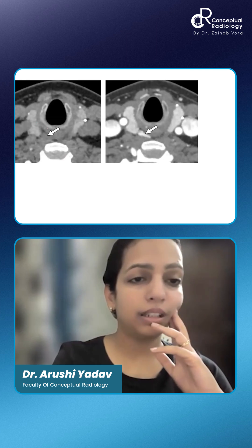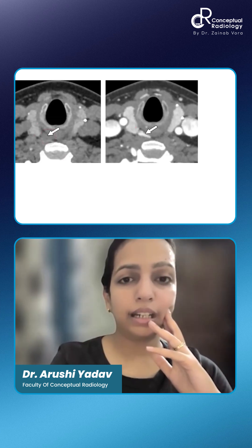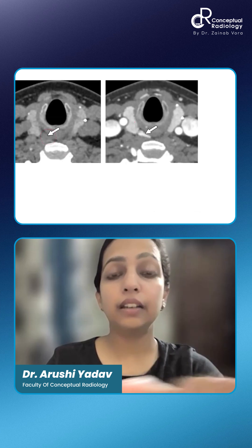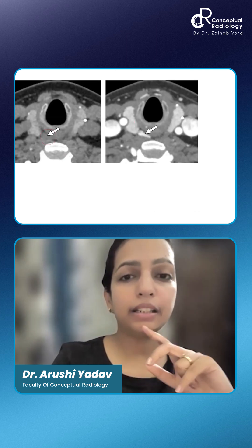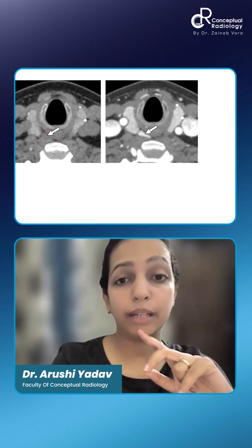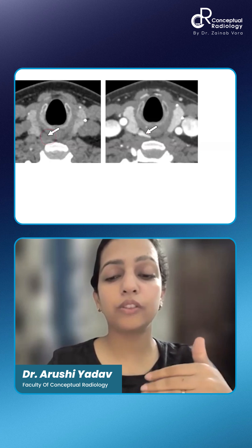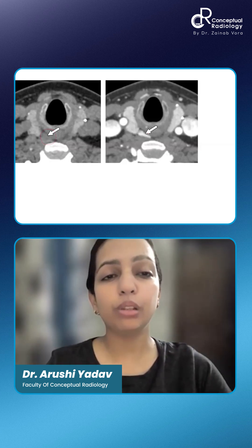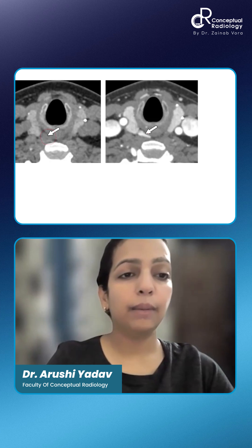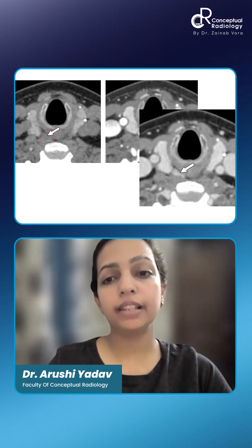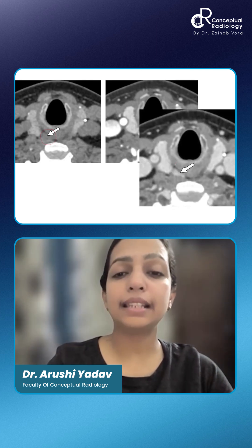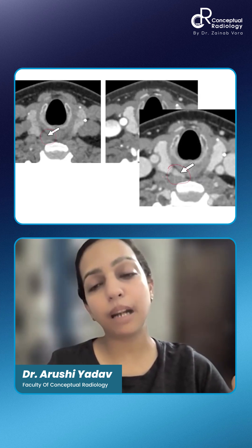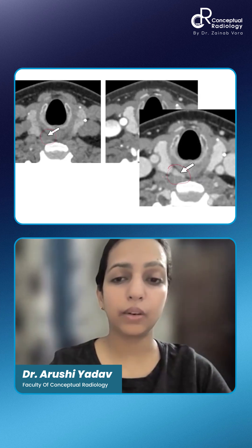Just like this — you see a lesion over here, and it enhances. It enhances like the thyroid, so you might say that it is very similar; it might be an exophytic protrusion of a thyroid nodule. But then you take a delayed phase and you see it is not as enhancing. It started showing a differential pattern of enhancement as compared to the thyroid.